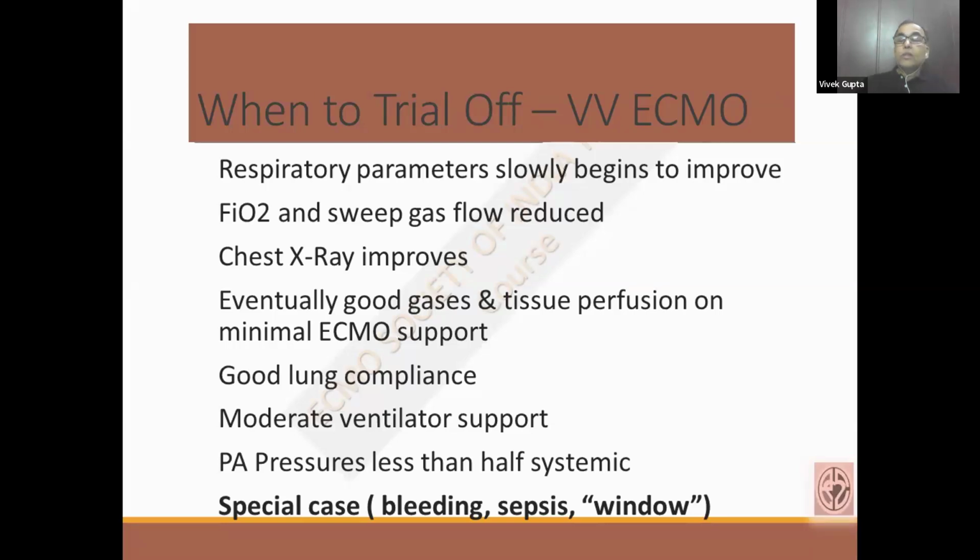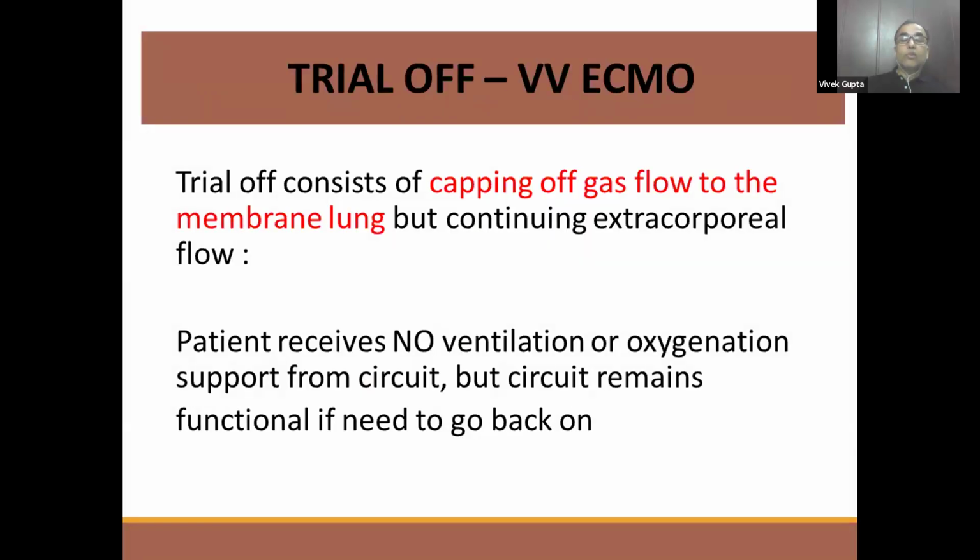So once you do this, you keep monitoring the blood gases and hemodynamics of these patients. If it is well maintained, there is no drop in the urine output, and the patient's work of breathing has not increased with a moderate ventilatory setting, that means your trialing off is successful and the patient is ready for decannulation.